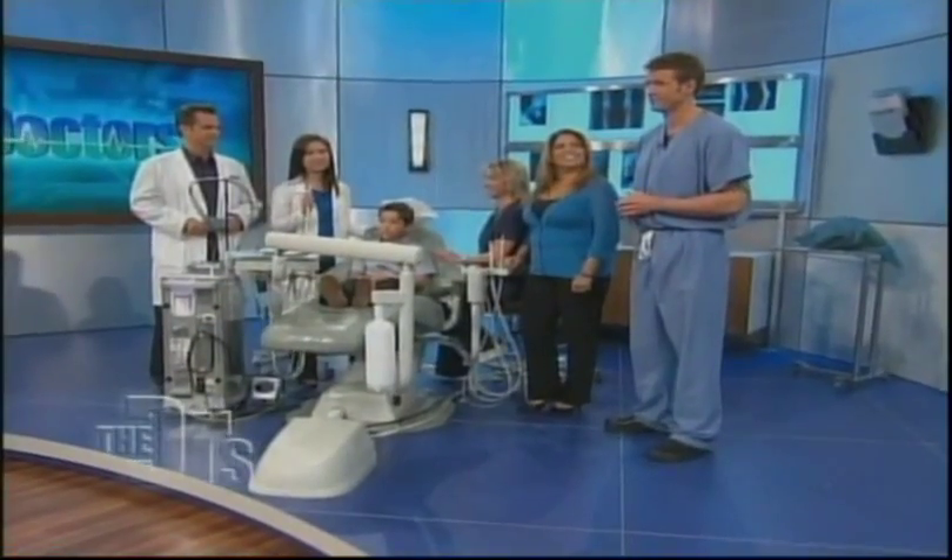How many of you out there have had a cavity filled? I know many of you hate that sound. Well, fortunately for all of us who hate that sound, it's becoming a thing of the past. We have a new Star Wars-like laser beam that makes getting the cavity filled absolutely painless.